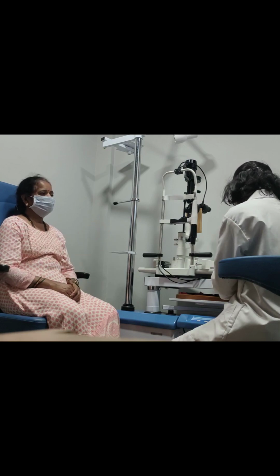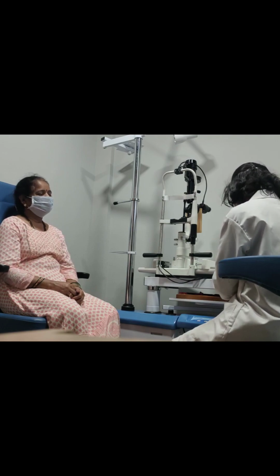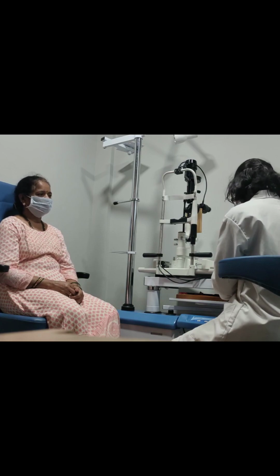Also, with the final power, she is able to read 6/36 print, so it won't affect her occupation, as she is a makeup artist. But she can always use yellow tinted glasses to increase the contrast.